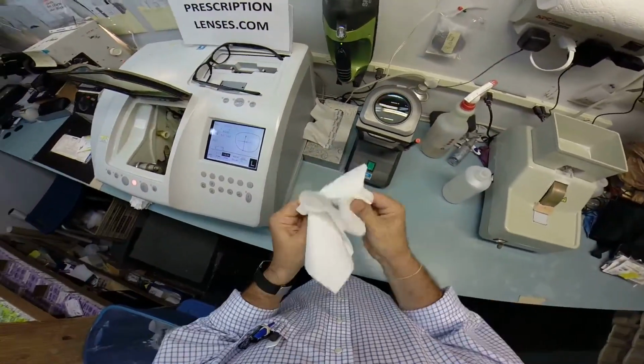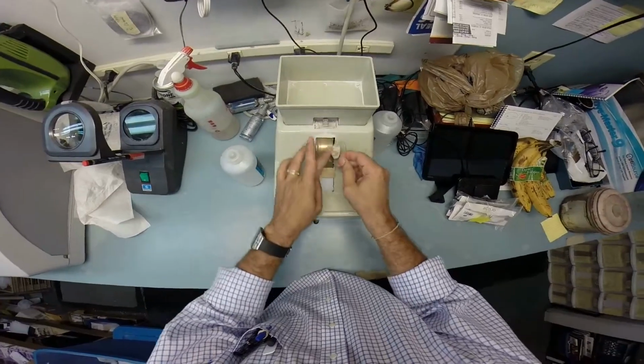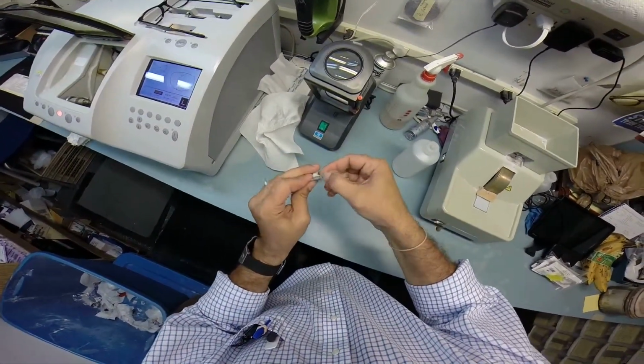So let's take this left lens out. Back to the handstone real quick for the safety bevel. Back to scraping this off your lens with my thumbnail.